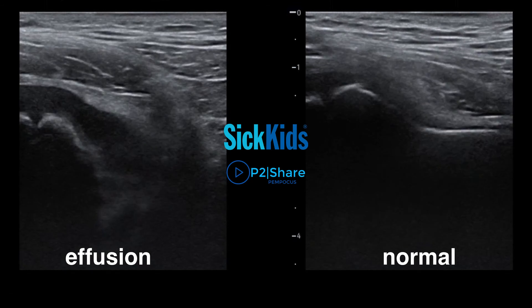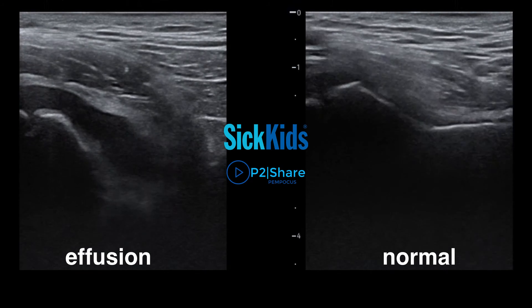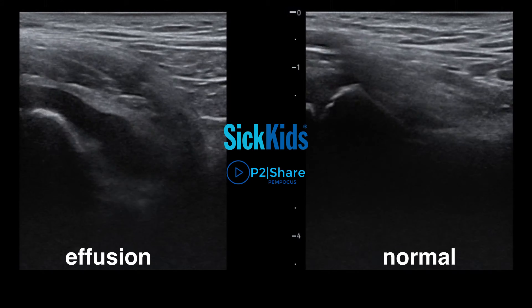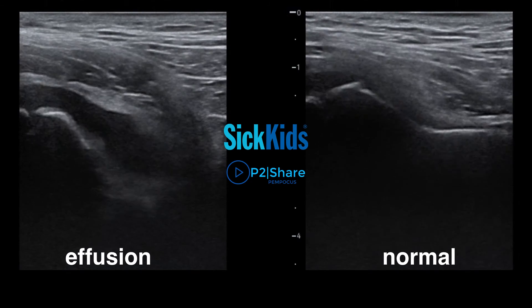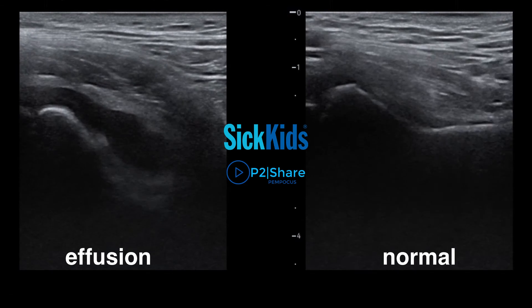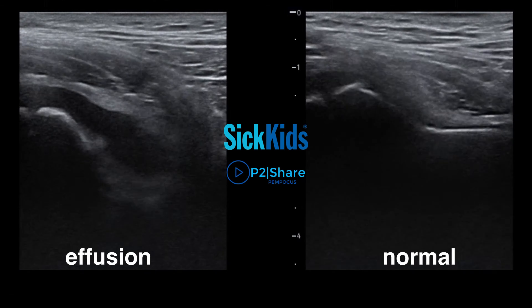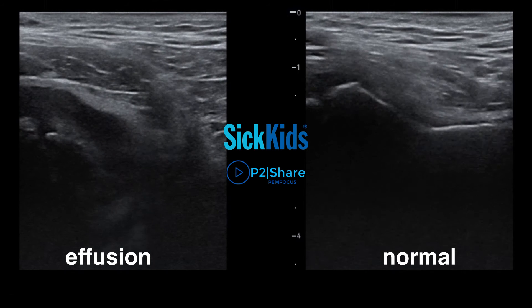The key is to always compare to the other side to see if there's a difference. The hypoechogenicity can be tricky because in cases of a purulent hip effusion, the fluid collection may not be completely black, so you should still take it into consideration.